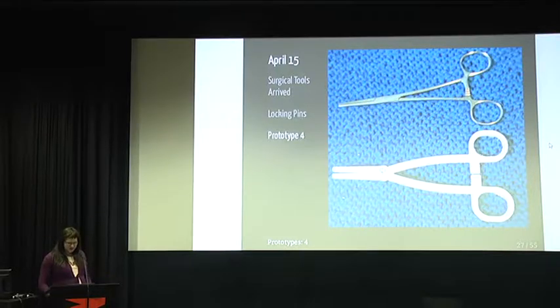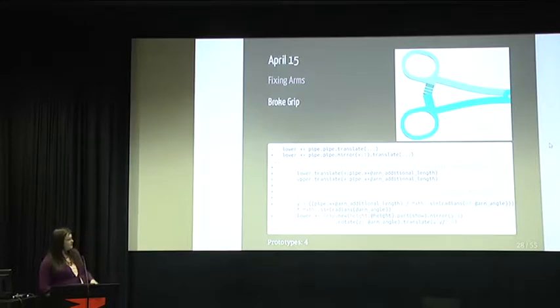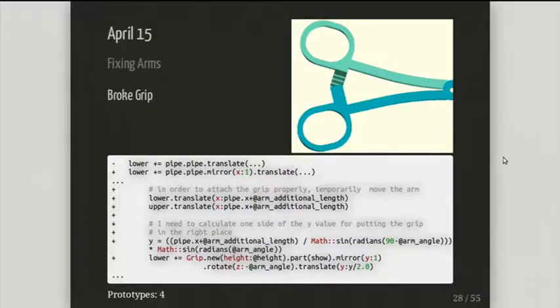I was frustrated. On this day I fixed the arm shapes and had to move some stuff around. I wanted to make another prototype that day but was too tired to also fix the locking pins — because by making the arm shape differently, I broke the locking pins at this stage. If you try to squeeze it, the teeth just won't match up, and it will not grip at all.